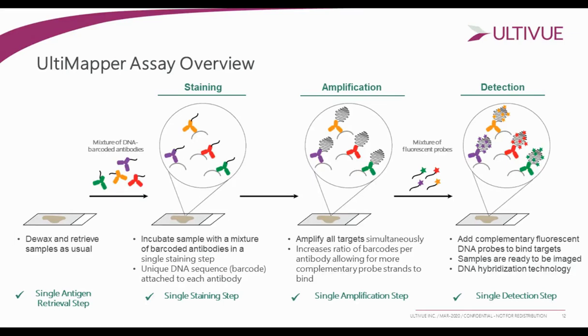Another thing to consider with this assay is that since we're not using secondaries, we're not providing a technology that causes any sort of covalent bonding or caking of things, such as a tyramide platform may do. It allows us to quite easily co-localize numerous markers within even the same cellular compartment at the same time.